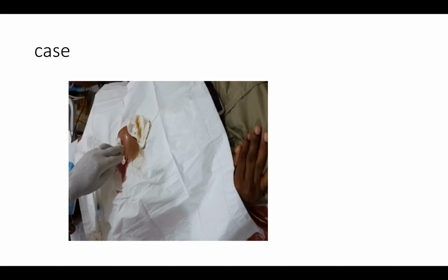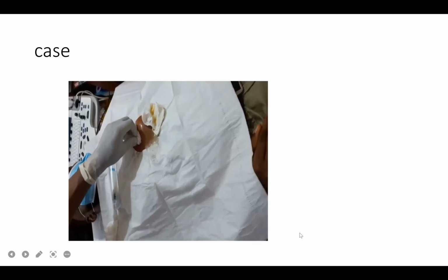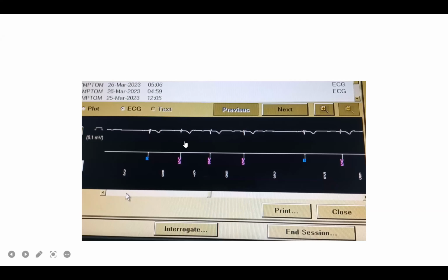It's less than 5 minutes. You just take a punch on that skin because the anesthesia has already raised the skin for you. So you take a punch on that skin, then you push it along, you turn it, you push it in, then remove it, then you close, and that is the end. For example, for this patient, when the patient had symptoms, we immediately implanted, then closed, then gave them a marker, and demonstrated to them how to use the marker when there is a symptom.